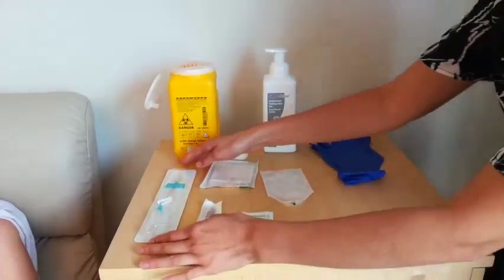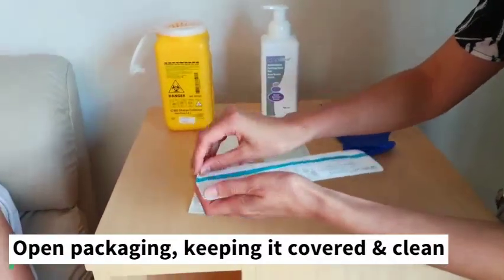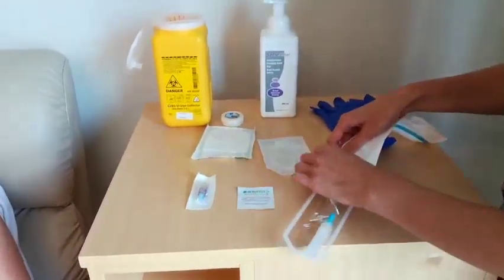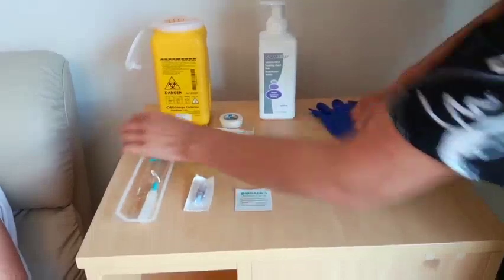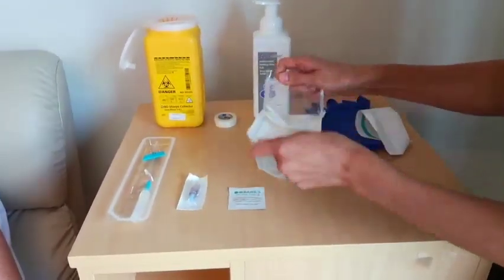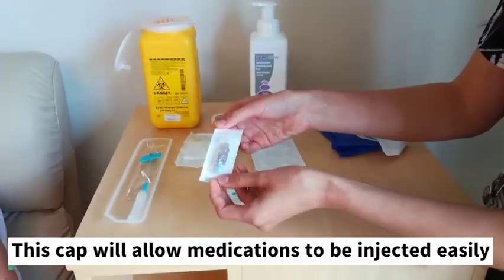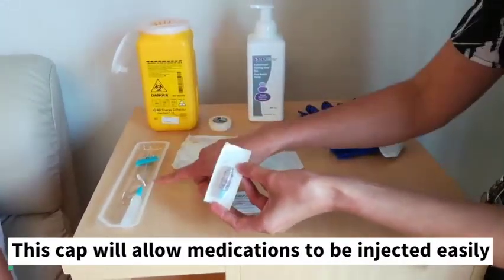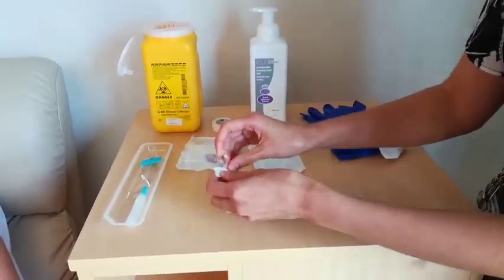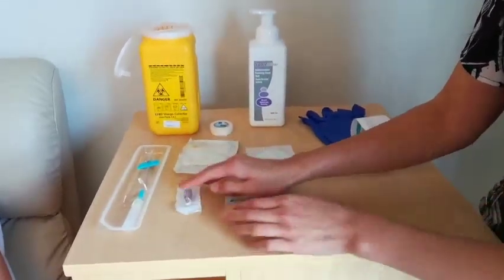Starting off with the equipment here again, we're going to open up and get everything ready. This tray here peels back and we'll open this gauze. This is a cap that allows us to inject medication into the subcutaneous line easily. We want to keep everything as clean as possible, so we'll just open and then leave it here.